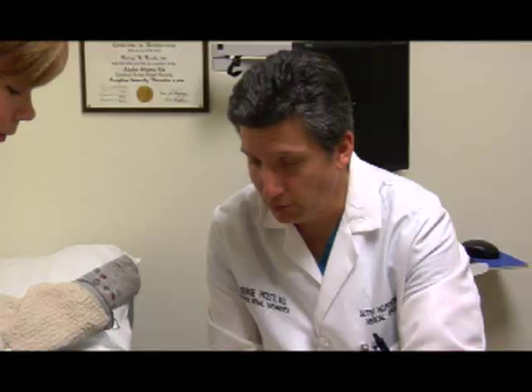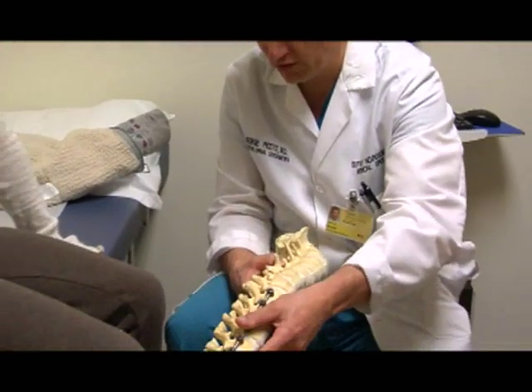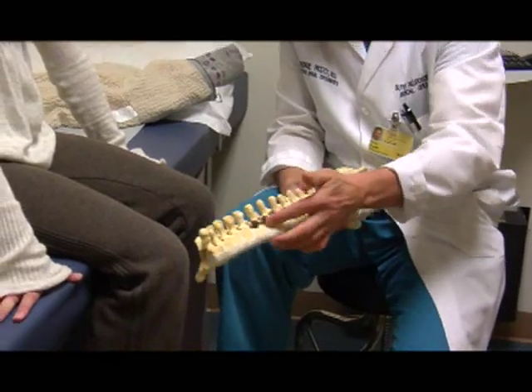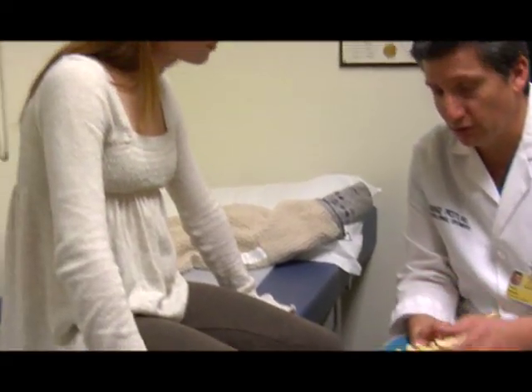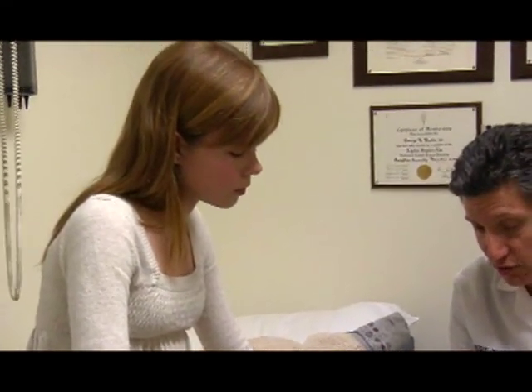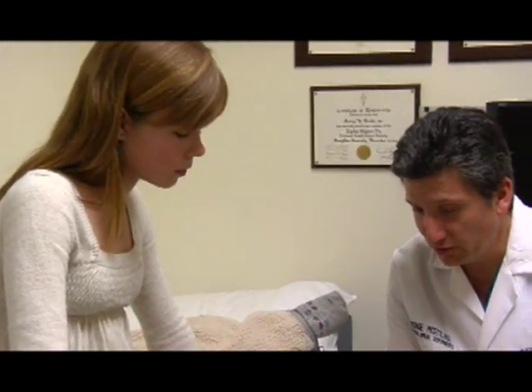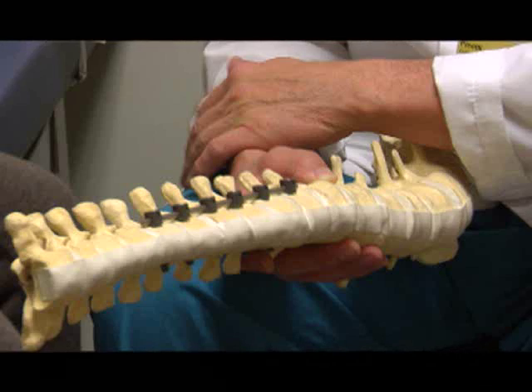Then we put our screws in, and once we get the screws in, we put the rod in. We correct the spine in kind of a lever motion — so if your spine's bent like this and you put the rod in down below, we press down to get the compression and correction. Then with a little tiny device, we squeeze all these levels together to get further correction and compression.